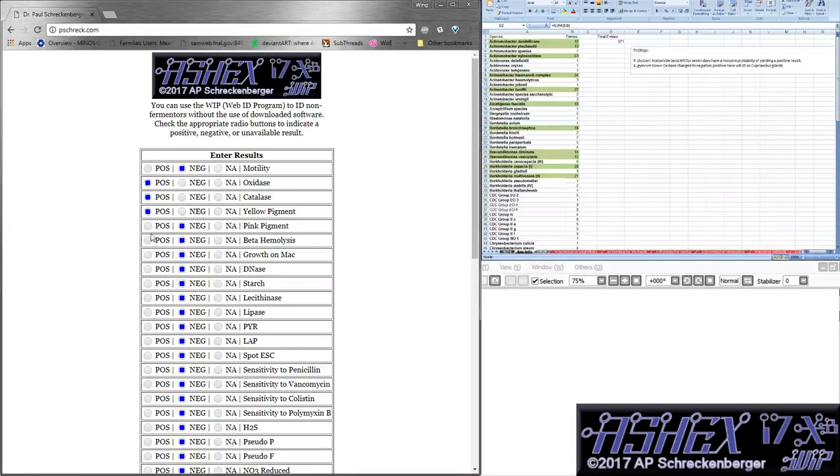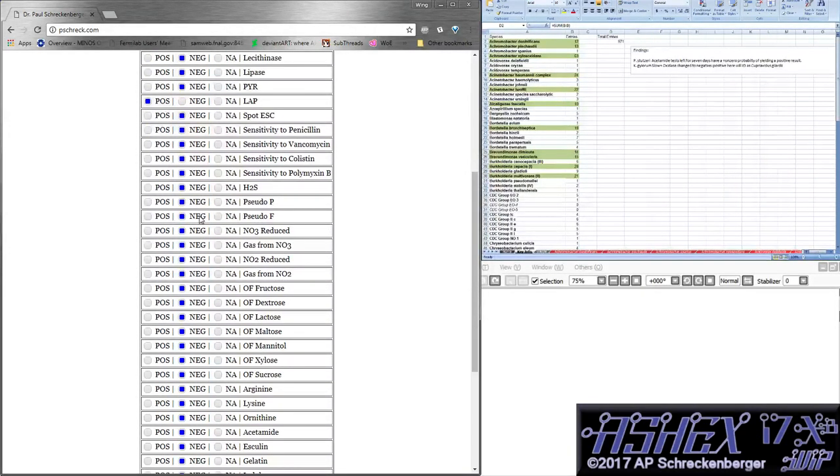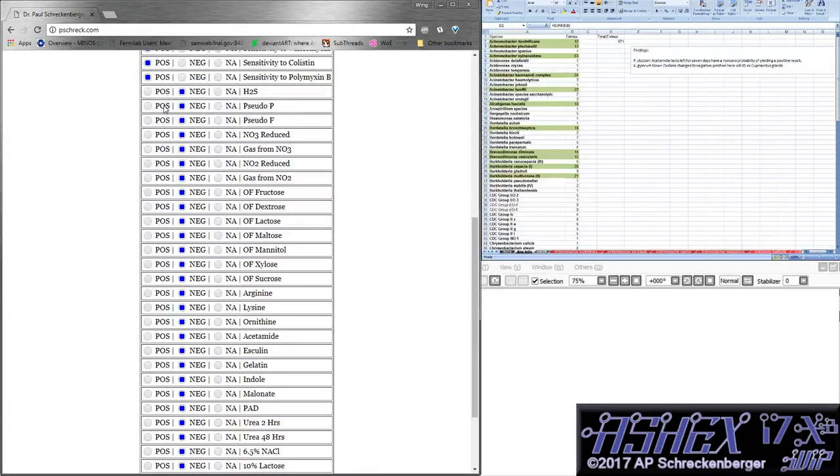So I'm just going to go through now and actually fill all these in, and we'll see how it does. Hopefully it should identify. It's pretty easy to go through and say, I'm going to find the positive ones now because everything else is negative. A little bit easier. This was actually requested by the techs at Loyola who were tired of clicking every button over and over again, which is a respectable and appropriate response.